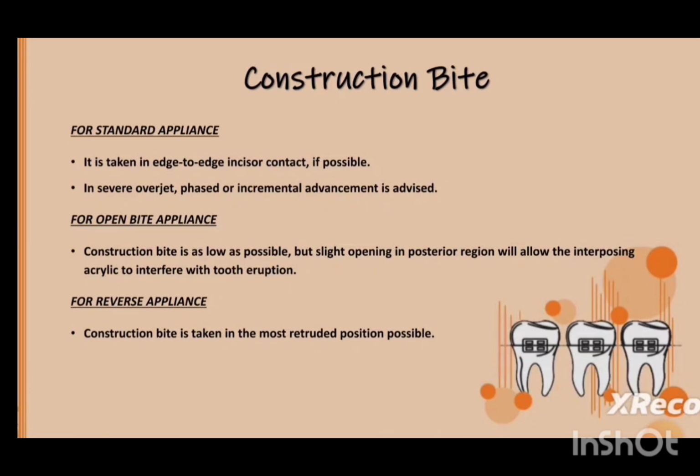For open bite appliance, the construction bite is as low as possible, but slight opening in posterior region will allow the interposing acrylic to interfere with the tooth eruption. For reverse appliance, construction bite is taken in the most retruded position as possible.